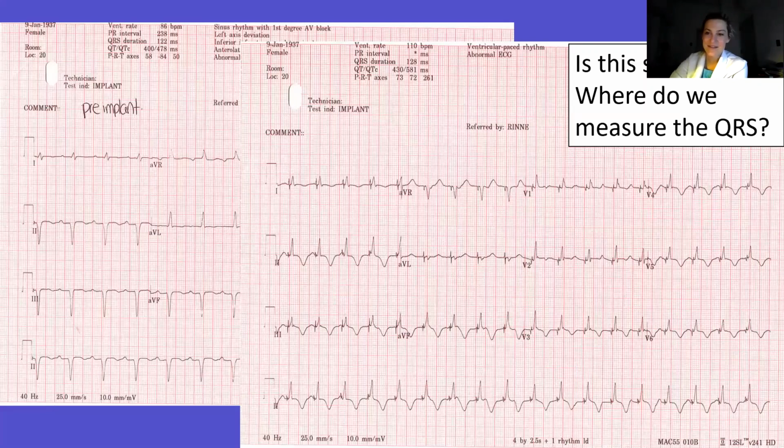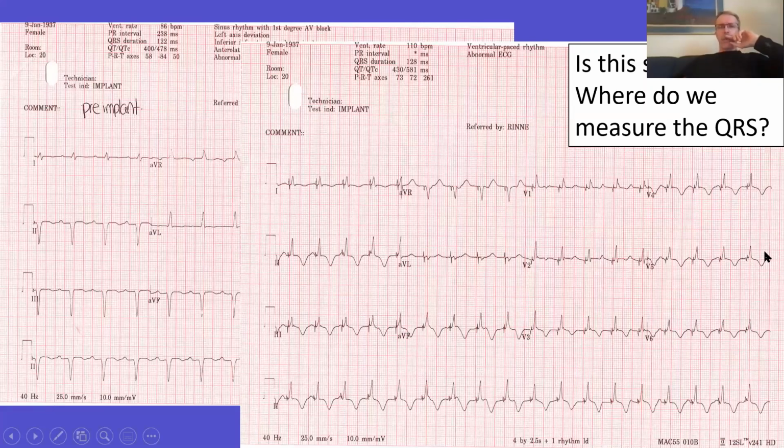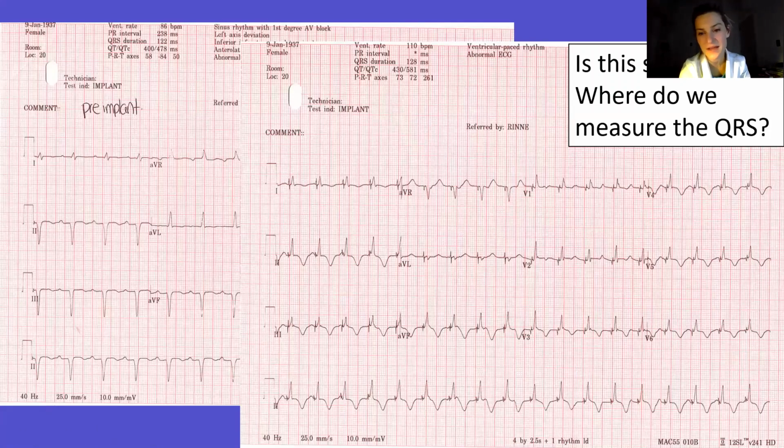My question is, people are measuring, this is like His measurements. Do you measure from the spike? You're leaving the latency out. Latency is kind of, I think, instead of fish stories, like bird watching stories. Yeah, it flitted by, I saw that bird. That latency, if you look hard enough, you can always measure 20 milliseconds shorter. I was just trying to stimulate some discussion about how people are honestly measuring latency. When you measure from the spike, I guess the computer is measuring it from the spike.